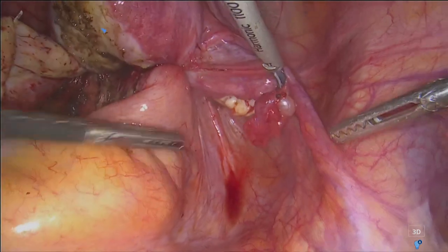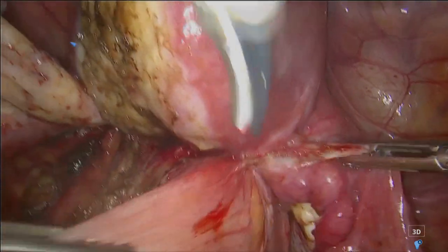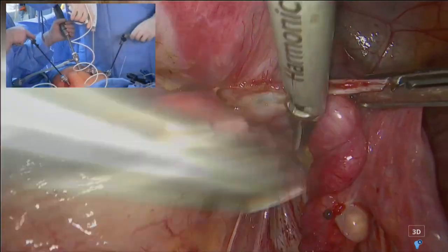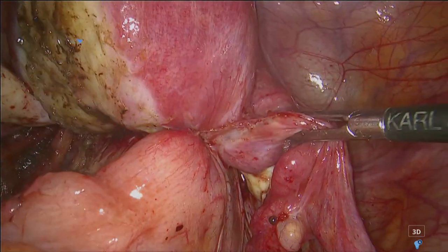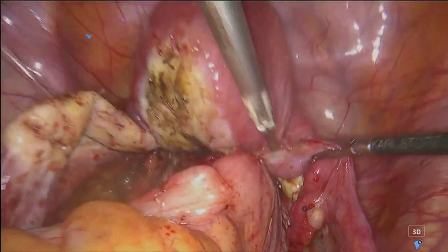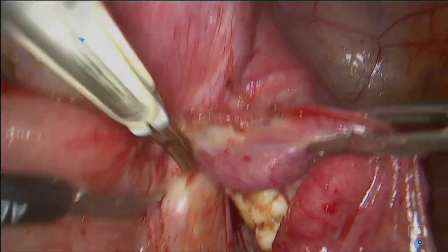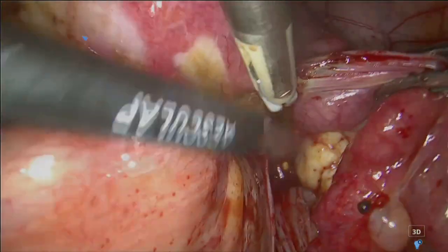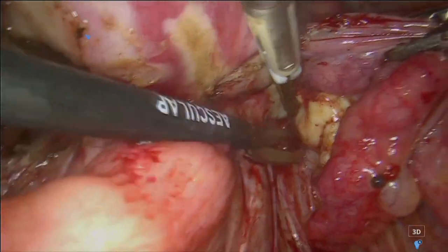And now on the right side, you see, first of all, it's better to free here the tube and the ovary from this part of the bowel, and then push laterally the ovary with the T-lift. Okay. Here probably it's better to work with the biclamp and the scissor, because this is a part of the nodule attached to the tube, starting from the posterior adenomyotic area in the retrouterine and retrocervical area. And this is the insertion of the tube, and the uterus is totally fixed posteriorly with very poor movement with the manipulator.